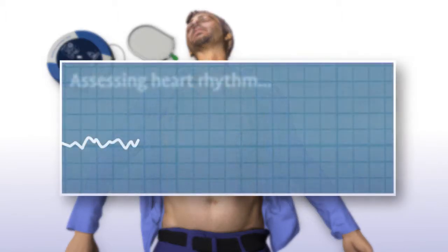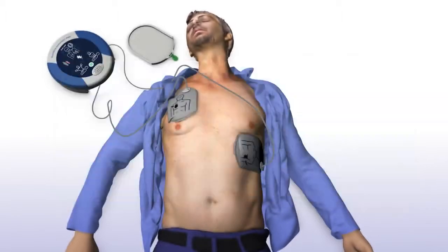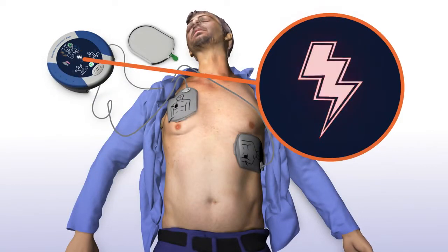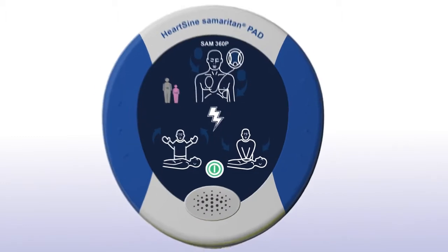The Samaritan PAD automatically assesses the patient's heart rhythm. Assessing heart rhythm. Do not touch the patient. And will automatically deliver a shock if needed. Stand clear of patient. Shock advised. Stand clear of patient. Shock will be delivered in 3, 2, 1. Shock delivered. When performing CPR, it's important to apply effective chest compressions for each 2-minute cycle as directed.